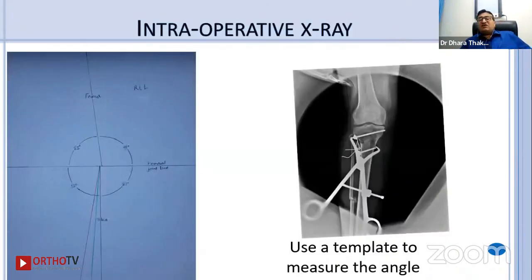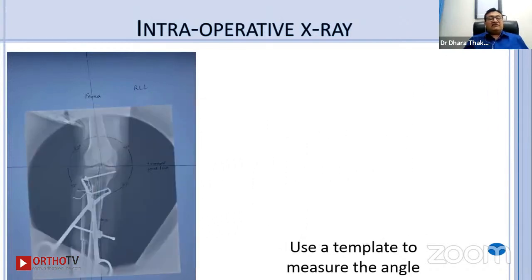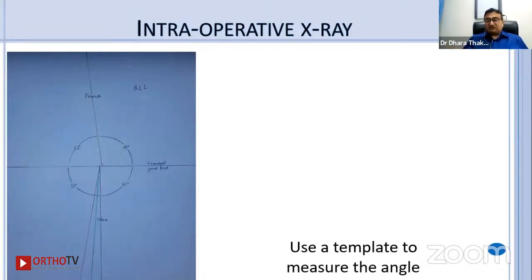Now, during surgery, we take a per operative x-ray like this after tension band wiring, and this clamp is being pulled. And this per operative x-ray, I put it on this template like this. And then I measure whether I have achieved the desired correction or not. Here we can see that the long axis of tibia is exactly here in the green line. That is 92 degrees, what we have calculated before surgery. If we are satisfied that we have achieved the adequate correction, then we do the remaining fixation, right? So this is the method to avoid the undercorrection.